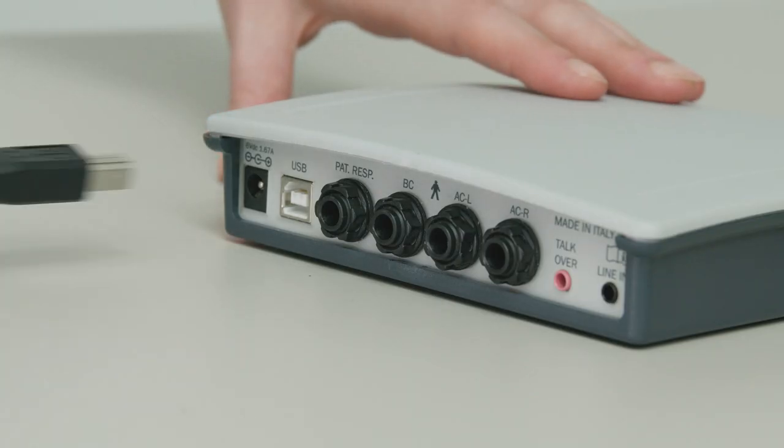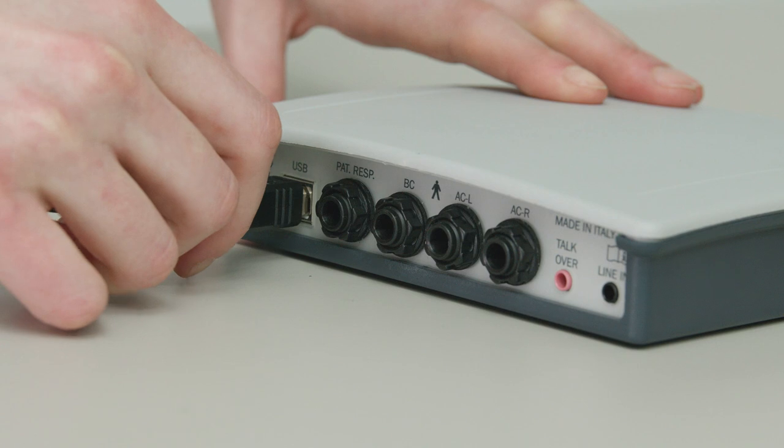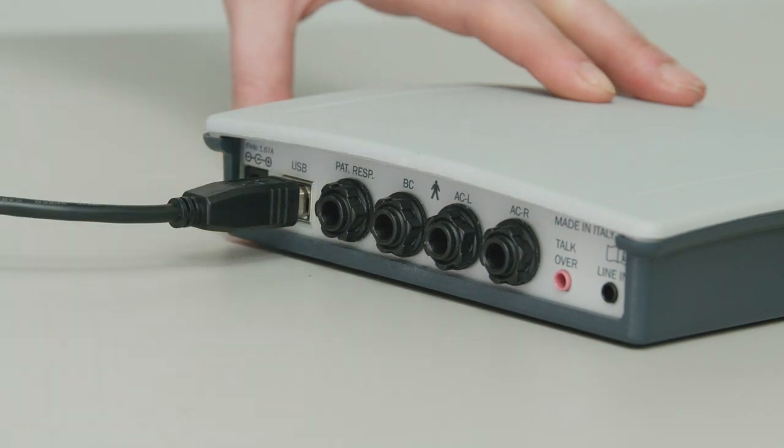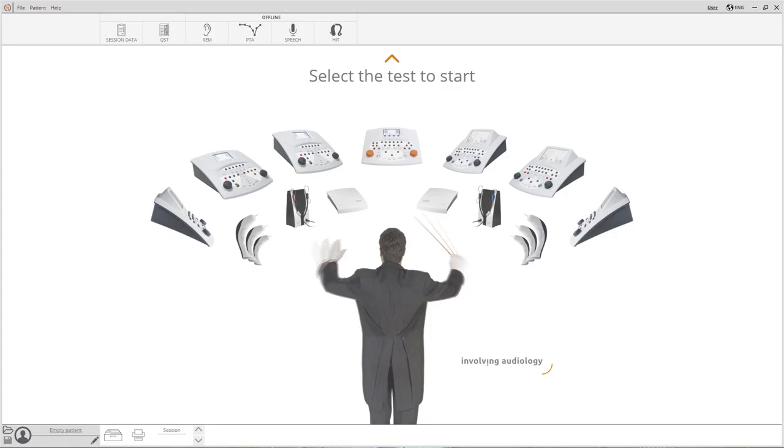Before starting to use Piccolo, the USB cable must be connected to the computer. Portability is guaranteed as it's not necessary to plug the medical power supply into the electrical grid. The operating system will automatically recognize the device with no need for driver installation.